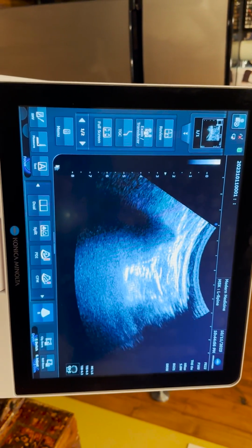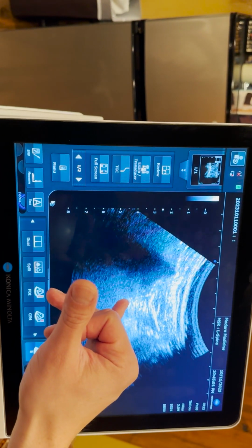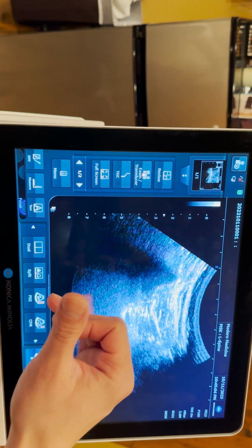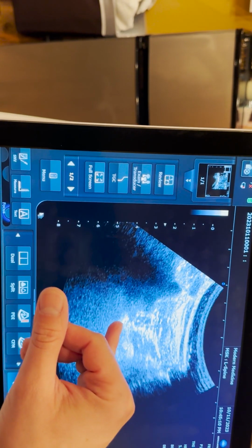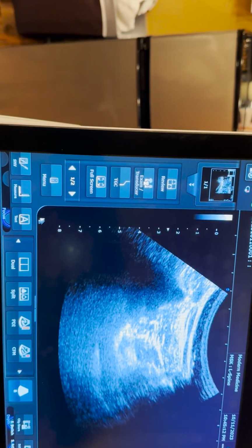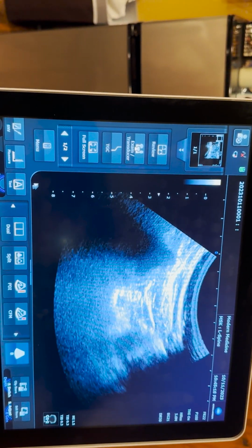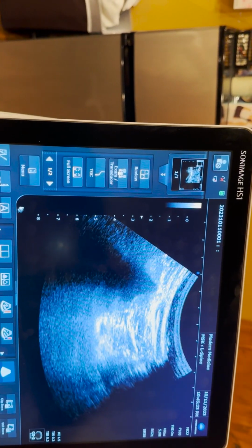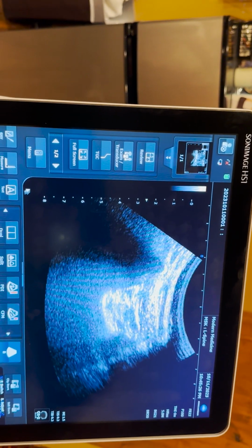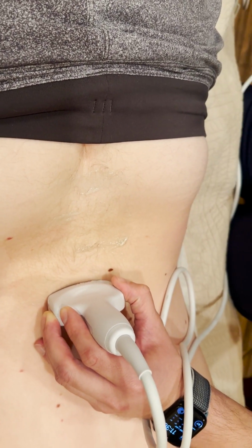So there we go. So sacrum right here, as it dips down into the SI joint, the sacroiliac joint. Now we do see those areas of that really bright white structure. Calcifications. Yeah, that could be a little calcification there, the arthritis already forming on that joint. So that would definitely be an area of evaluation or potential causative agent of the pain that the patient is experiencing. Yeah, I find this fascinating that you can do this ultrasound and pick up injuries.